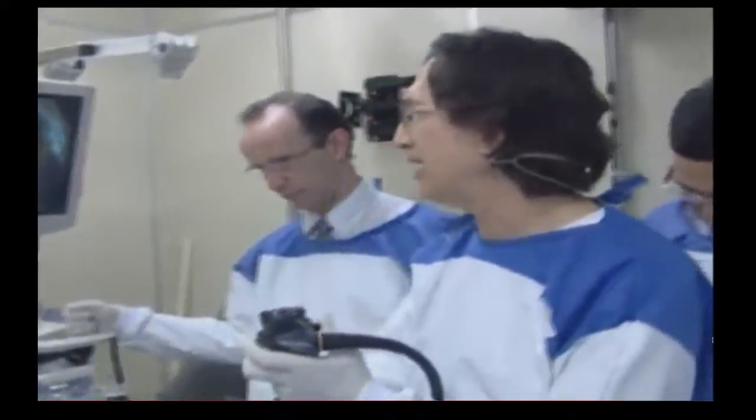Okay, so this all looks very nice, and I'll start to come out now, and then you have a final view. You see there's no risk of bleeding from the dilation. The limitations, the problem with pseudocyst drainage has been the complications related to dilation. Dilation causes perforation. Sometimes you think they're adherent, the cyst and the wall of the stomach, but it's not really adequately adherent. And as you dilate, the walls separate from one another. And the other complication is bleeding. Now, I've had patients who I personally had to wheel into the OR that were exsanguinating from arterial bleeding.